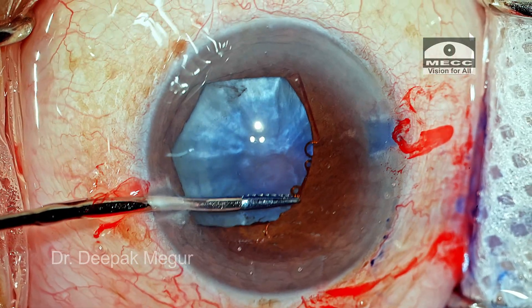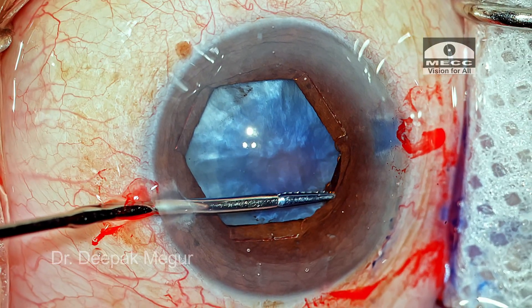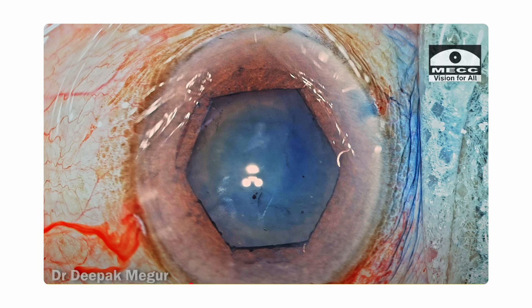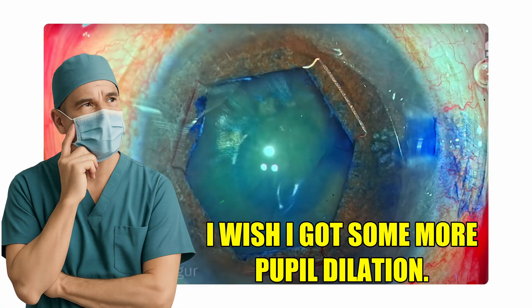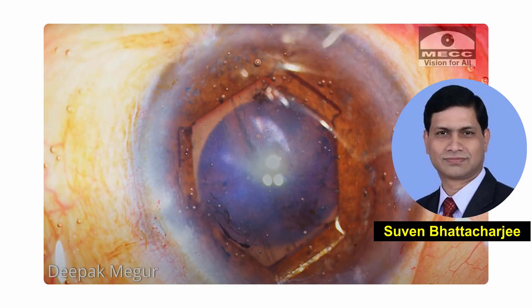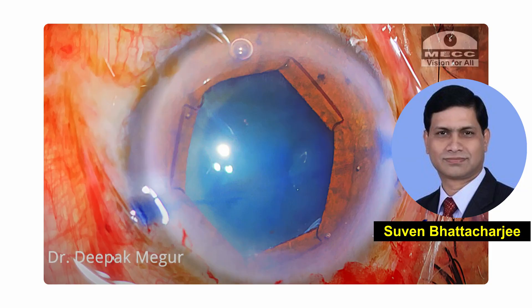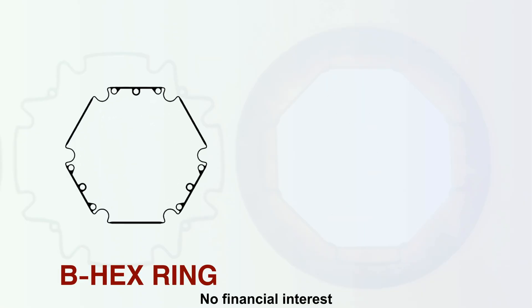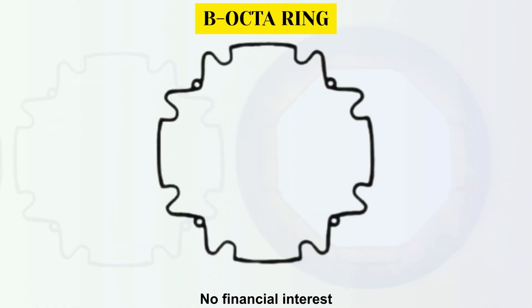The simplicity of the design, its thin profile, and ease of use remains unmatched. But in a few case scenarios, we wished that BX could dilate the pupil a bit more, and we would tell this to Dr. Sovane. He listened, and lo and behold, now we have the newer sibling of the BX — the B-Octa.